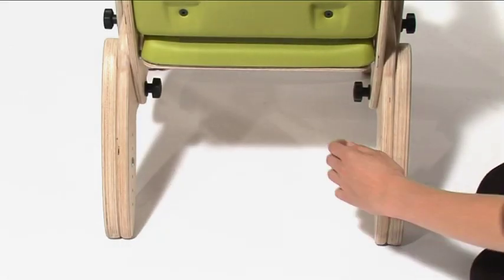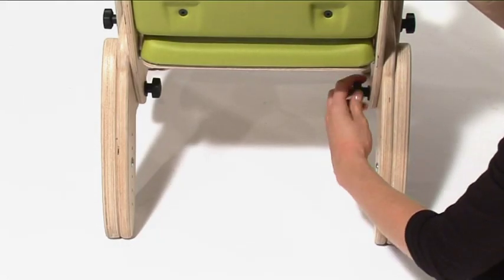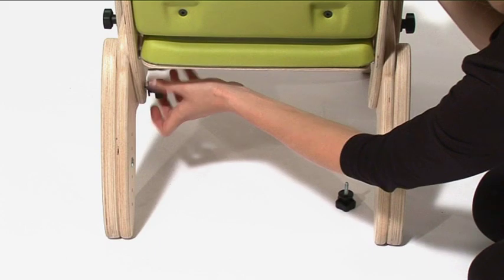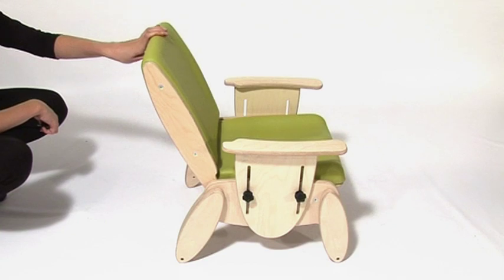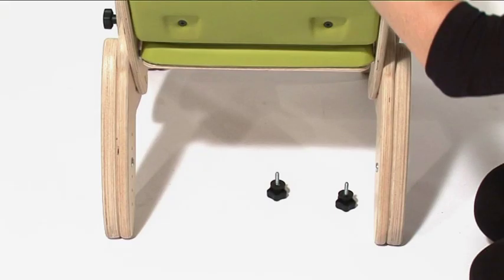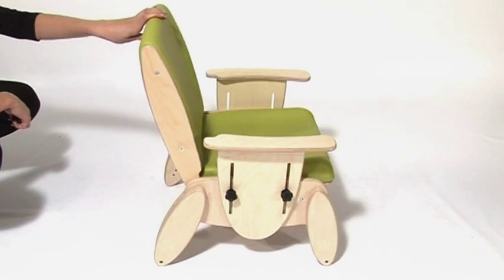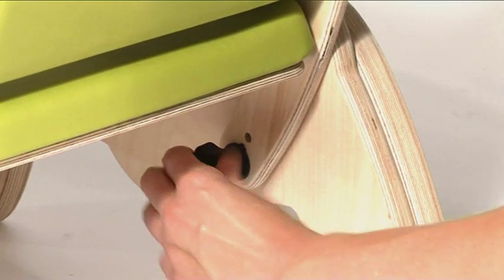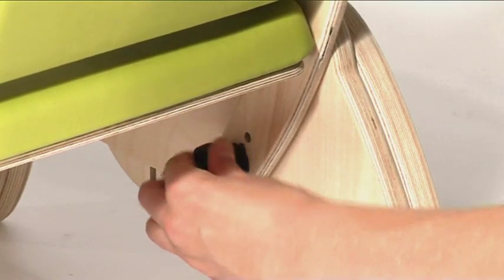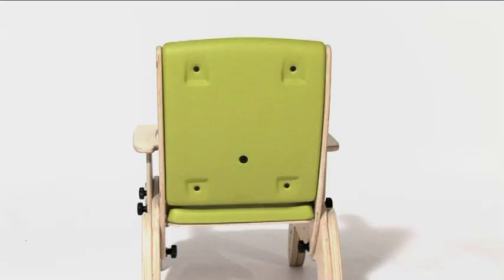To adjust the angle of the back, locate and remove the two hand wheels securing the back seat recline angle. The Junie seat back can be reclined in steps of 5 degrees, from 95 degrees through to 105 degrees. When the desired back recline angle has been achieved, simply insert and tighten the two hand wheels.